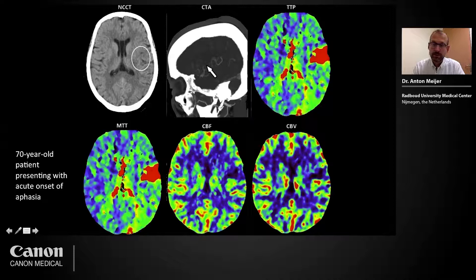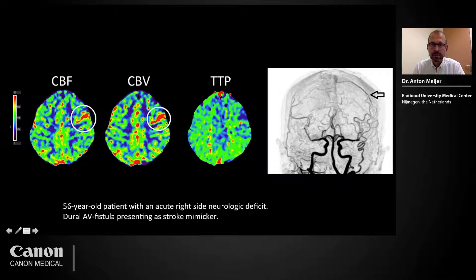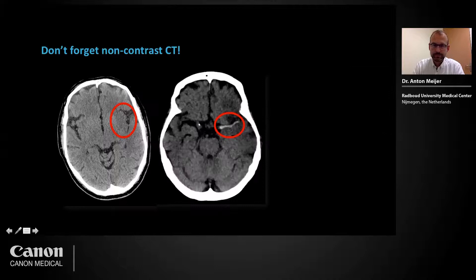CT perfusion can aid in the detection of intracranial vessel occlusions. This is a patient presenting with acute neurologic deficit on the right side. On brain CT perfusion, an asymmetry is seen in the left cerebral hemisphere, but this pattern is atypical of acute ischemic stroke — there is a pattern of hyperemia with an increase in cerebral blood flow and cerebral blood volume. When looking at the 4D CTA rendering of the CT perfusion acquisition, an abnormal early-enhancing cortical vein is easily seen. This was a patient who had an arteriovenous fistula presenting as a stroke mimic. Do not forget the importance of non-contrast CT, as early ischemia and intracranial vessel occlusions can also be detected there.